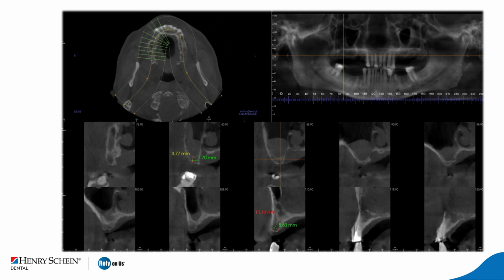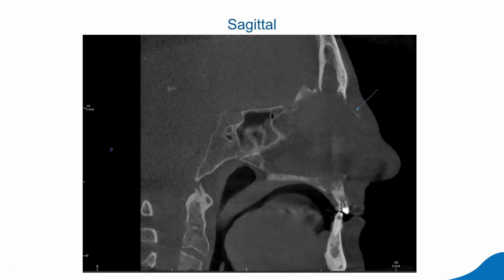The periosteal reaction will be as in inflammation. So you will have some bone produced, you will have thickening. Something is going to tell you, well, there's an infection in there and the body is trying to react. Well, you don't see anything like this here. You have those lytic changes, but it's so aggressive that the bone doesn't even have time to react. So that means very serious problems are going on. And in that case, after biopsy, the patient was diagnosed with squamous cell carcinoma of the nasal cavity.